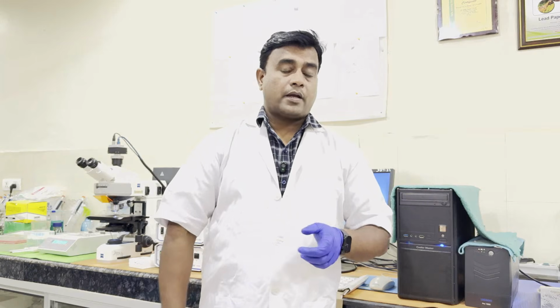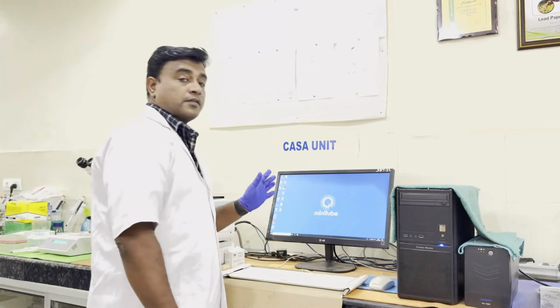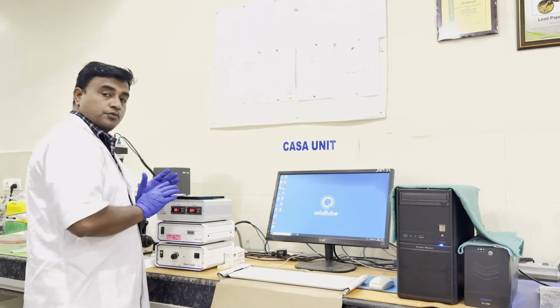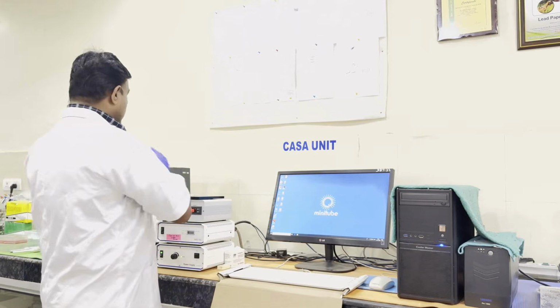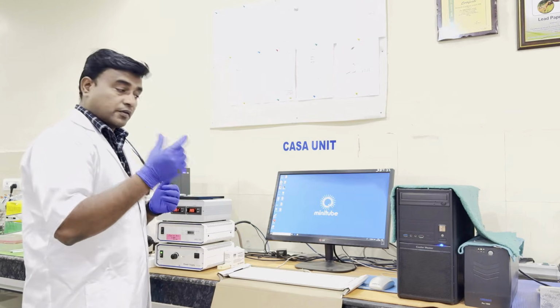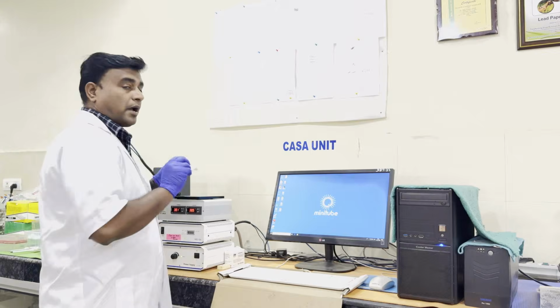Hey guys, welcome back. This is part 2 of the lecture where we will try to understand the basic setup of the CASA. In a CASA setup, we usually use chamber slides, and this is an open microscope so that you can also use common slides. But here we use the Makler chamber.